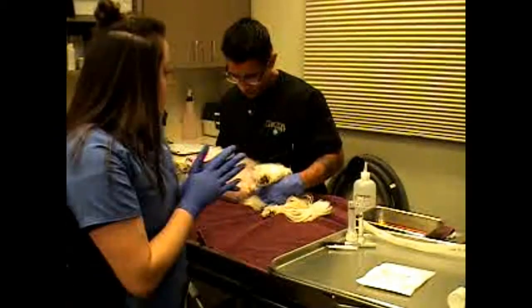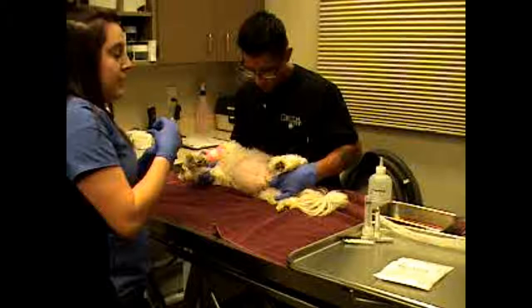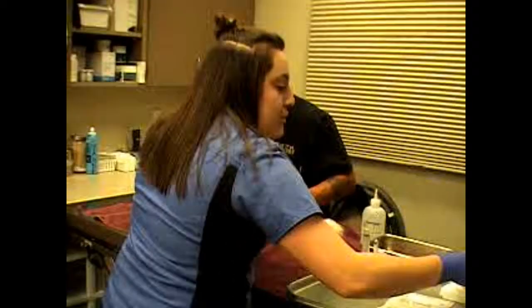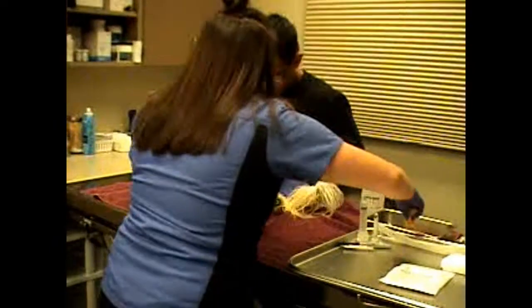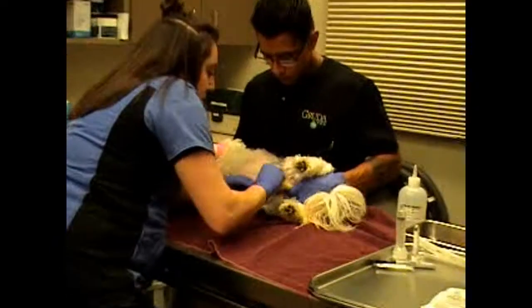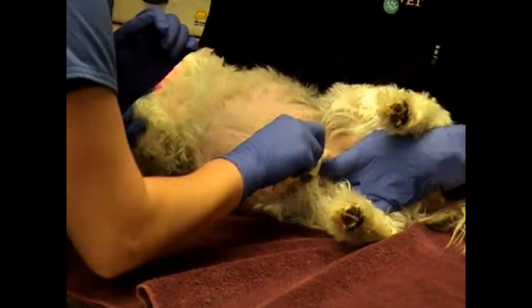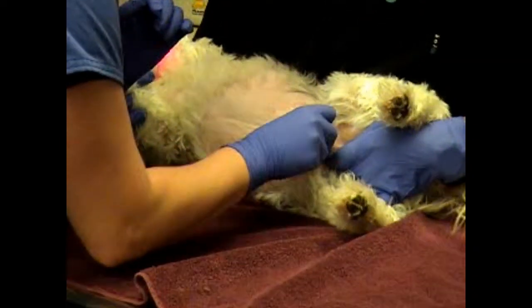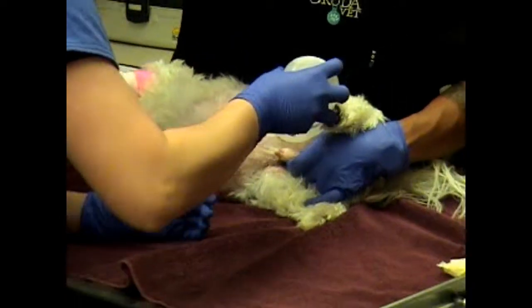So first things first, we're going to have Juan extrude that penis from the sheath, and we'll take some of our 3x3s and just kind of soak them in a little bit of betadine. And we'll just cleanse the tip of that penis just to take away any bacteria, anything that's just right there on the surface before we actually introduce that catheter. And then we'll rinse with sodium chloride.